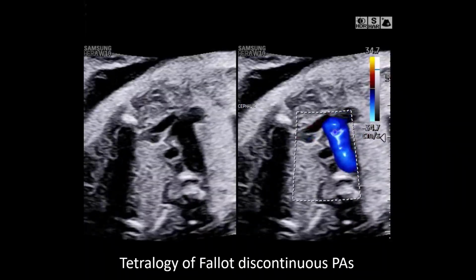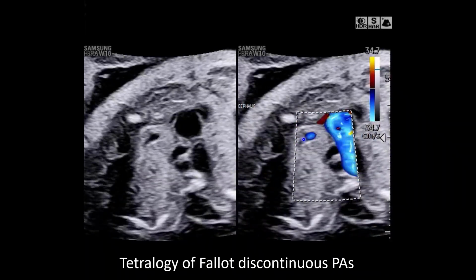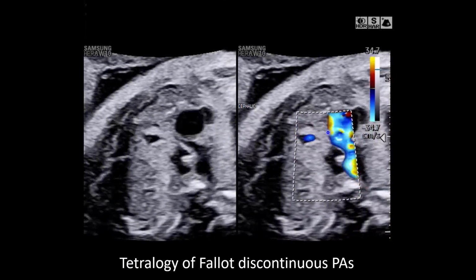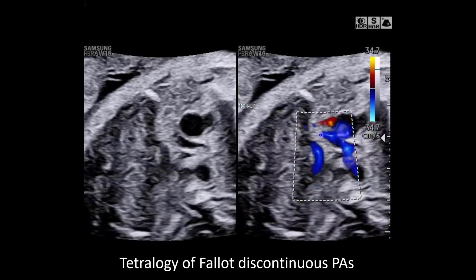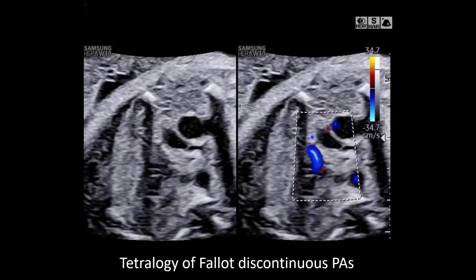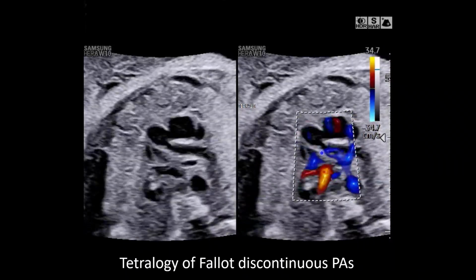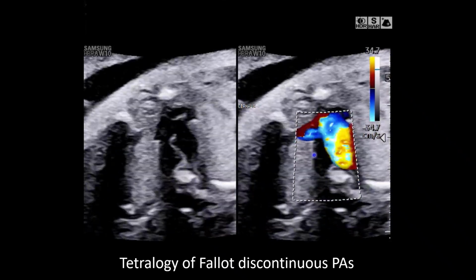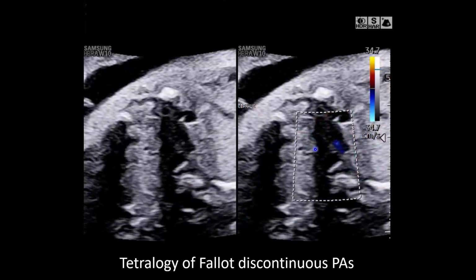This is actually a right aortic arch with mirror image branching. You see that first vessel coming off and going that way to the left upper chest, sort of laterally through the chest. And so that's the left subclavian artery right there. If you keep your eye trained right in that spot where the blue dot is, that is actually where the ductus arteriosus comes off. And if you look closely, the left pulmonary artery arises from that ductus arteriosus. And so this is a discontinuous left pulmonary artery from a left ductus arteriosus.